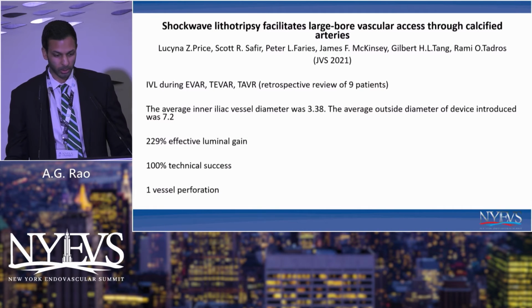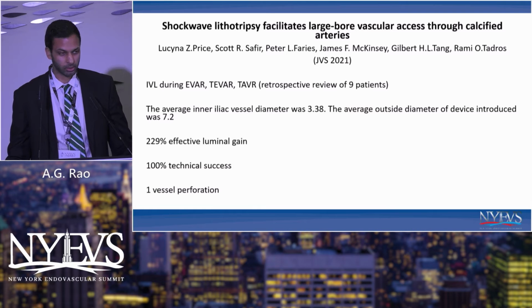There's a study that came out recently with some very familiar names here, looking at lithotripsy to treat large bore vascular access during EVAR, TEVAR, and TAVRs, and it was a retrospective review of 9 patients. And what they found was they were really able to expand that vessel to much larger diameter. So it was a 229% effective luminal gain.